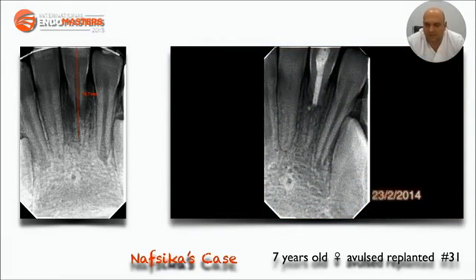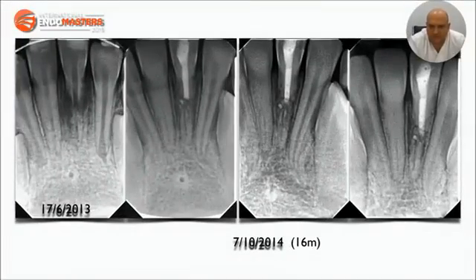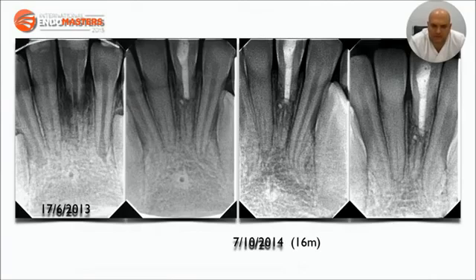And this is the radiographic image 8 months afterwards. And the comparative image, how we started and 8 months afterwards. And this is the 16 months follow-up radiograph compared with the initial situation. Healing is evident, no signs of ankylosis, mobility within normal limits, no probing depths.